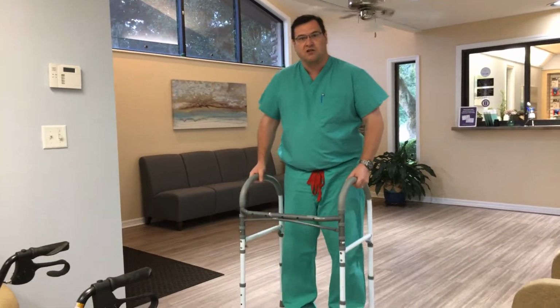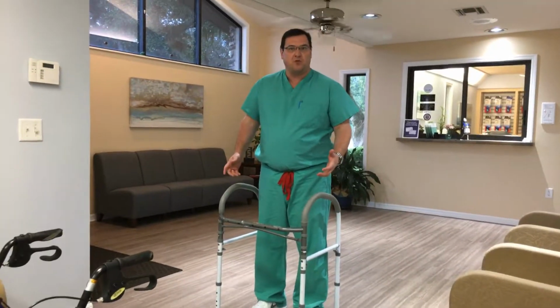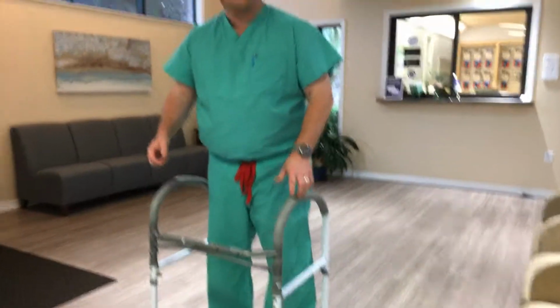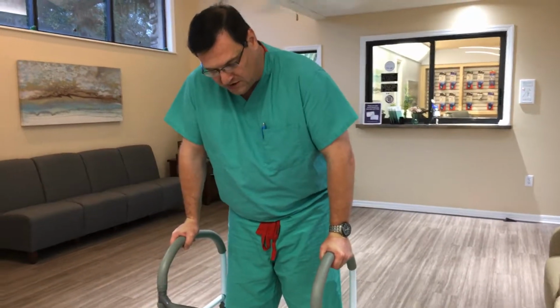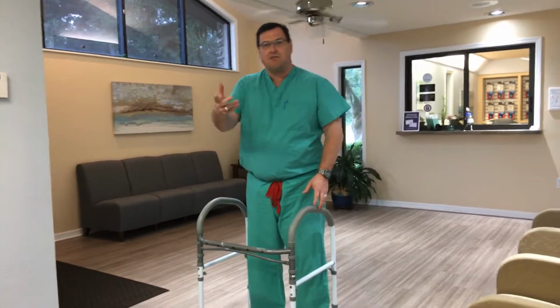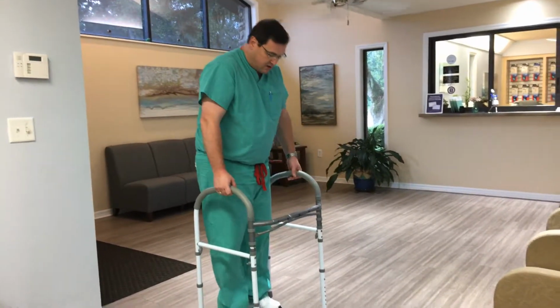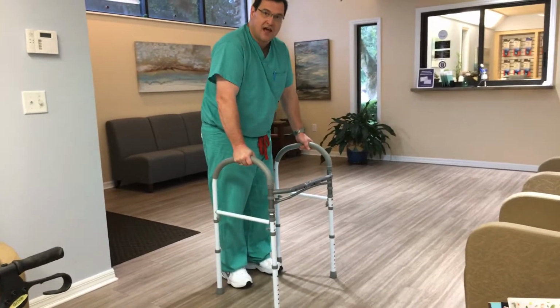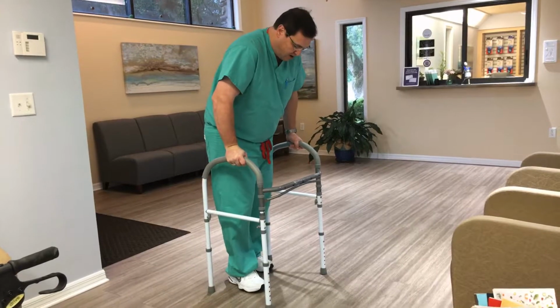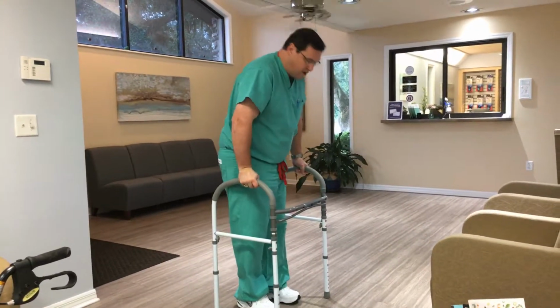So the best walker to use basically is going to be a 4-prong classic walker without the wheels. Sometimes they'll come with the wheels attached. You can take the wheels off of the front, okay? But because it has 4 prongs, it's stable. It's not going to slip or slide out from underneath you. And it's the same process that I just showed with the wheeled walker. You bring the walker forward, just half a step. Bring your foot forward, half a step. Weight on the arms, foot comes up. Walker, half a step, weight on the arms, foot comes up.